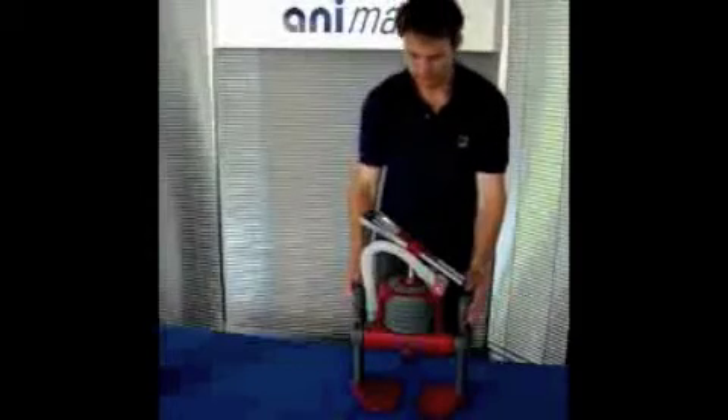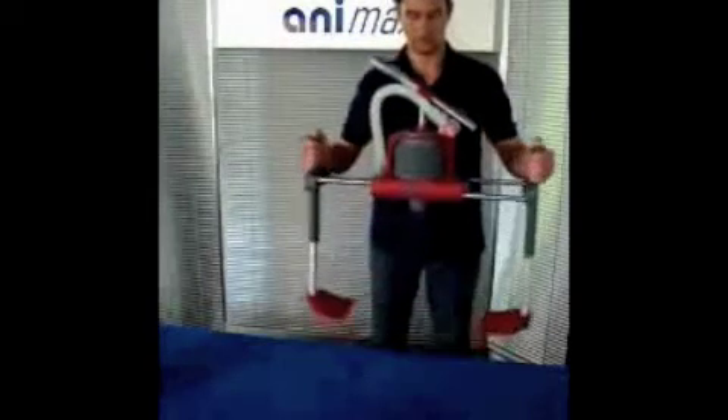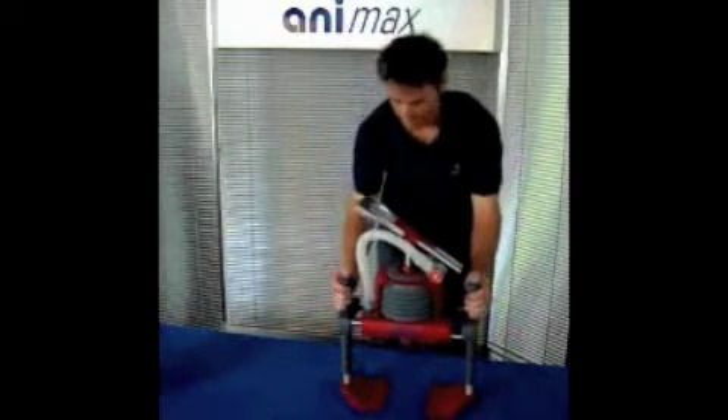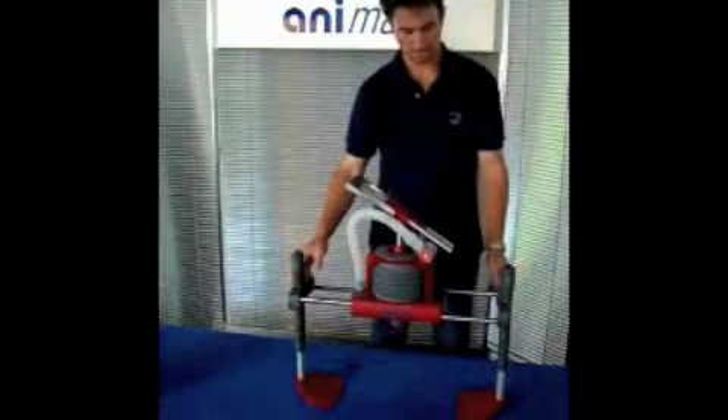Animax is adjustable in height and width by pushing the buttons on the grips. The portal frame adjusts itself symmetrically, which is why the device aligns itself with the center of the body. If you release the buttons, the portal frame locks in the momentary position.